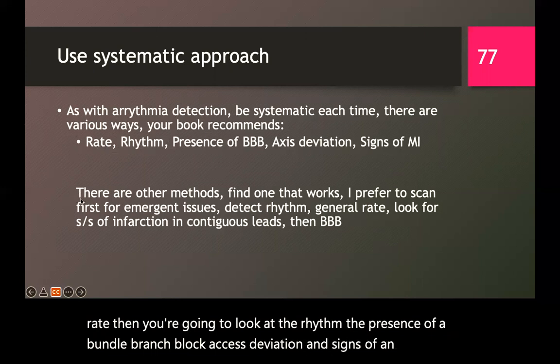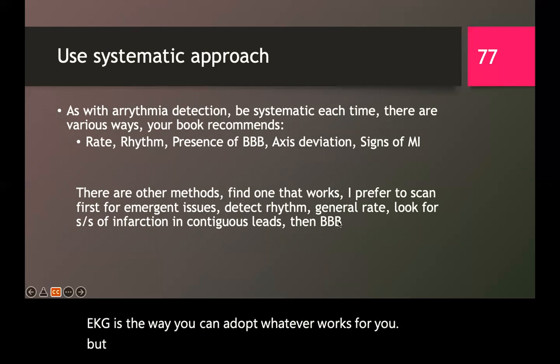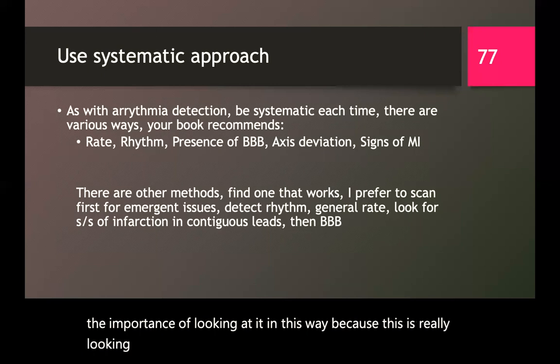Okay. There are other methods or other systematic approaches for EKGs. You can adopt whatever works for you, but in this particular system, we pointed out to you the importance of looking at it in this way because this is really looking for emergency situations before anything else. That would be really important to be aware of.